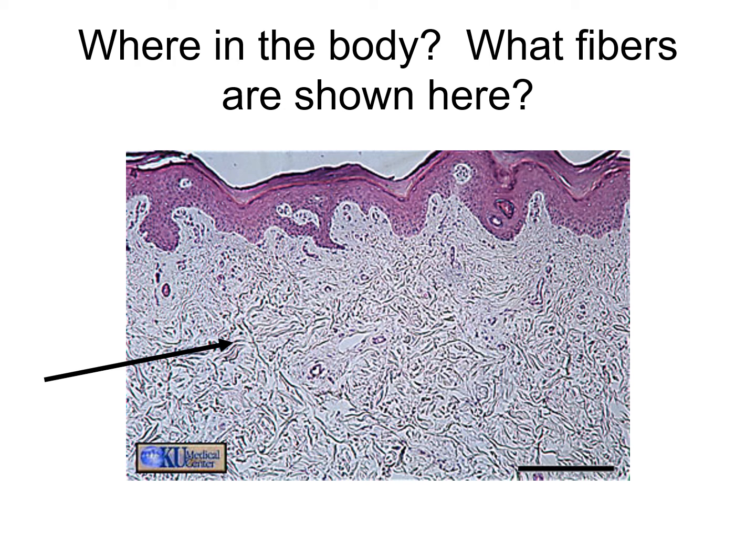The skin? It is a skin. Specifically, the arrow is pointing to the dermis of the skin. But which layer of the dermis? The reticular? It is. And so what fibers do we find there? Reticular fibers. See, that's where it gets misleading. It's dense, irregular connective tissue, and it's predominantly collagen.